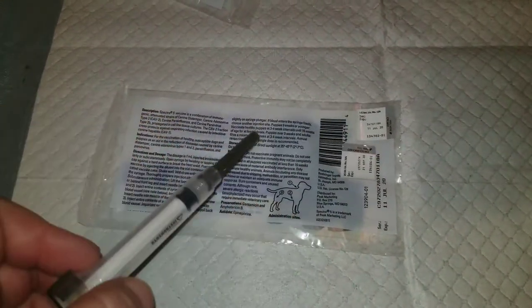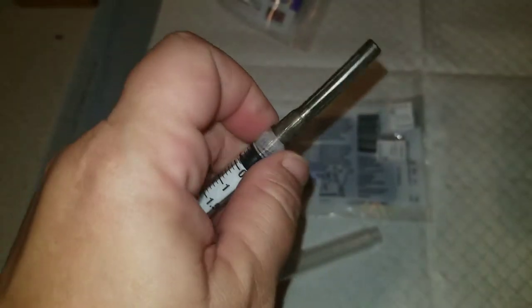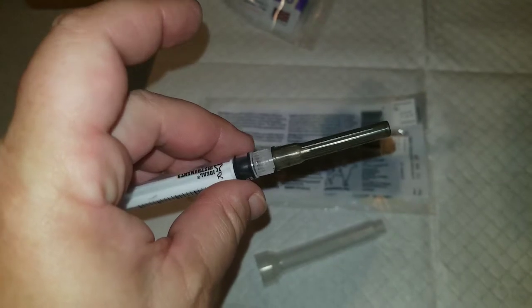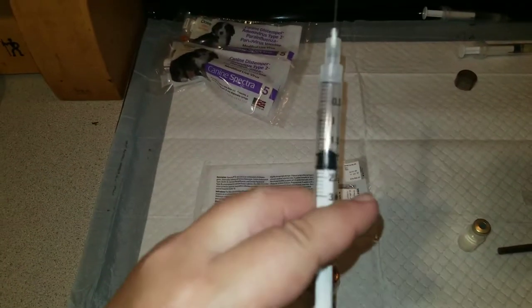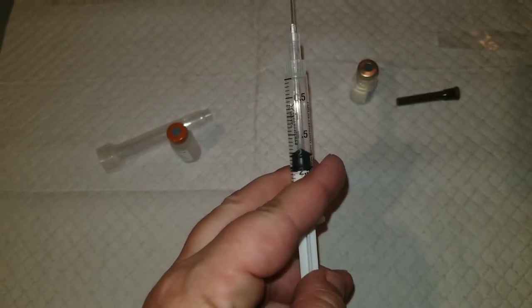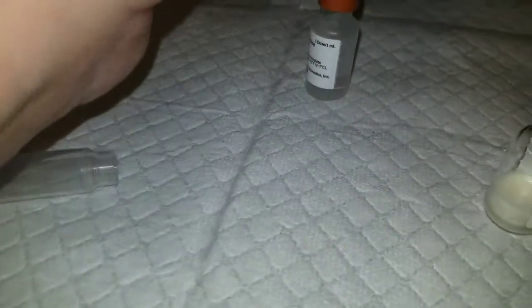Once you have your stickers on the packaging, it's time to open the needle. This has a safety package on it so that you don't get stabbed. You twist the back off — it should make a popping sound because it is sealed. Pull the needle out of the packaging, and I like to twist the needle to make sure it's on there tightly. The last thing you want is a loose needle while you're trying to mix your vaccines. Then I pull the plunger back to the two milliliter mark.